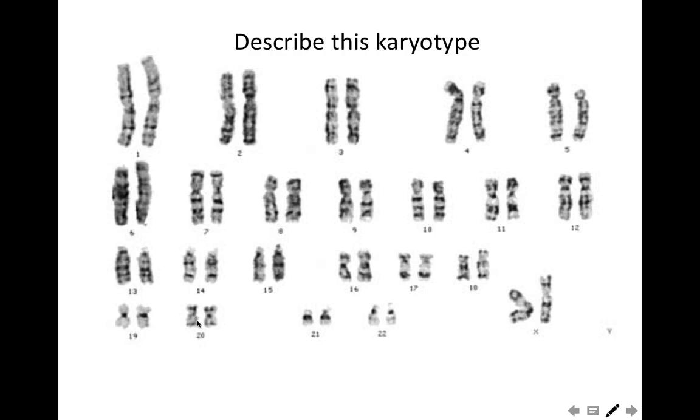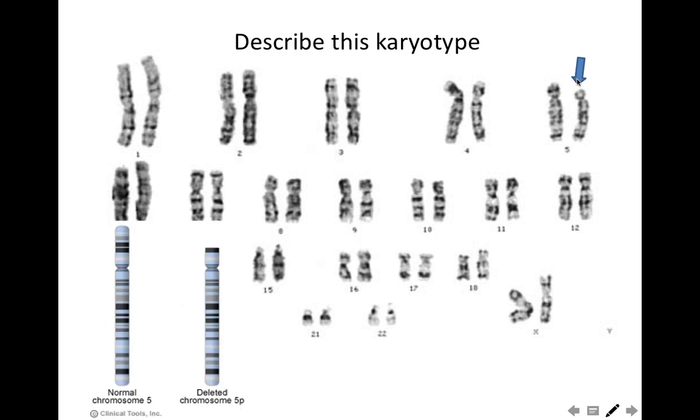Well, I cannot see any other abnormality, so description of this karyotype will be here. The only abnormality is the broken terminal part of chromosome 5, deletion 5p, and so the description of the chromosome هو represented هنا بالايديوجرام. يبقى شفنا هنا ايه فايدة الايديوجرام؟ ان انا بقارن الكاريوتايب بتاعي النتيجة بتاعتي اللي بتطلع من الكروموسوم study.